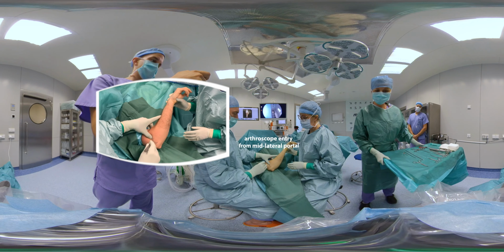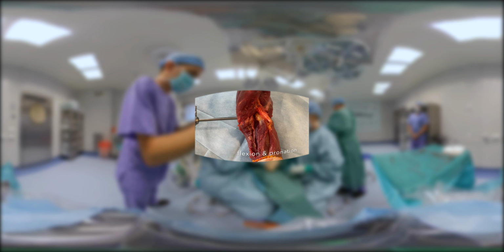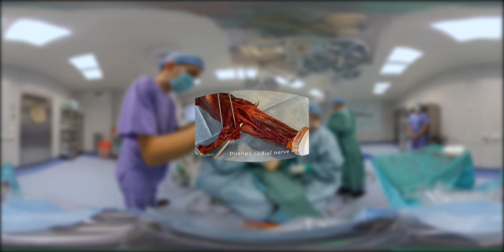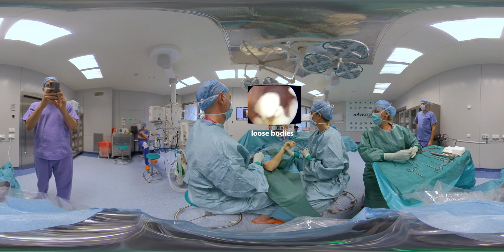Elbow is flexed to 90 degrees flexion and full pronation. Flexion and pronation moves radial nerve away from the joint capsule, leaving more space for safe entry. Multiple loose bodies are the first items to see after entry.